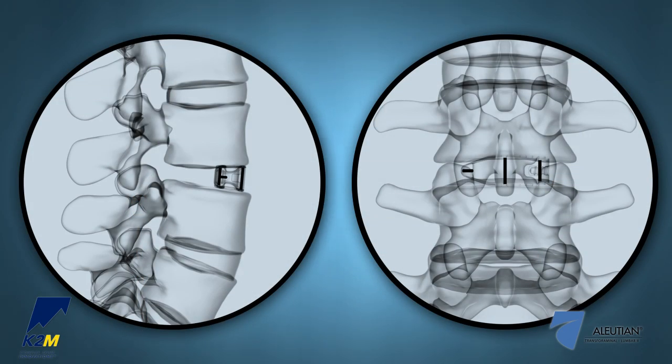Under ideal implant placement, the medial tantalum marker will be aligned with the spinous process in an anterior view, and the posterior markers will form a sideways T in a lateral view.